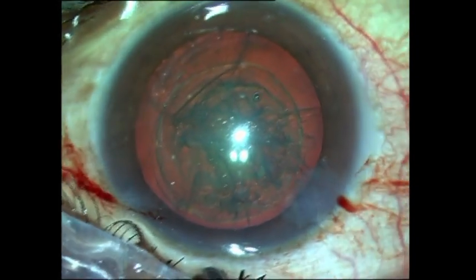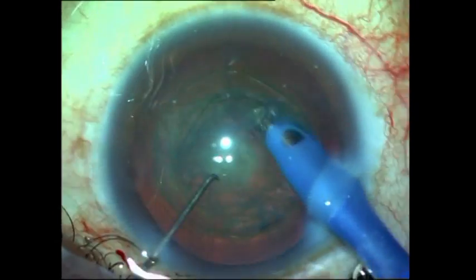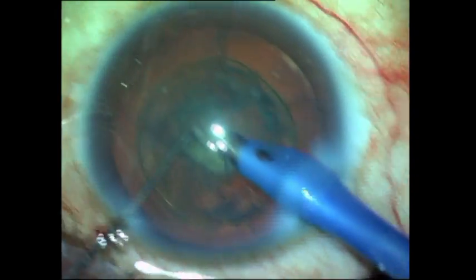What I do next is to go ahead and try to get that soft nucleus outside. The nucleus in posterior polar cataracts is generally soft and the patient presents early because of the opacity being in the nodal point of the eye.